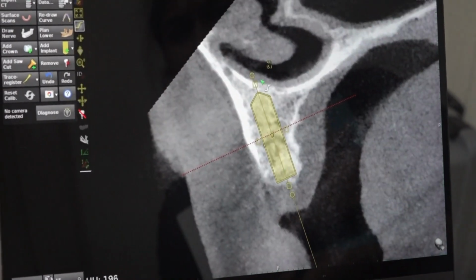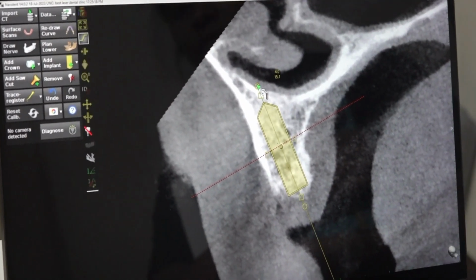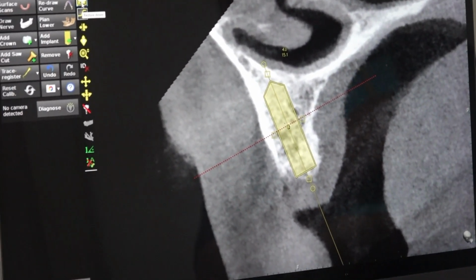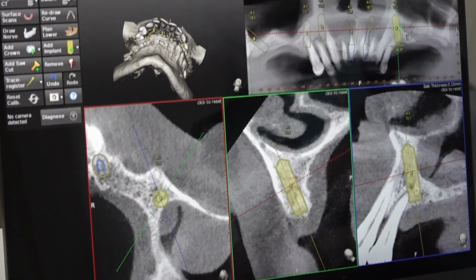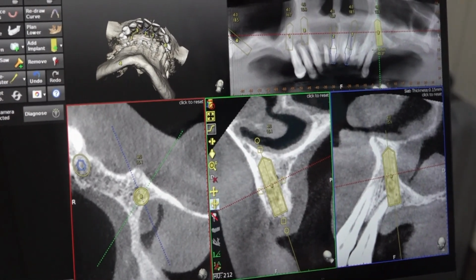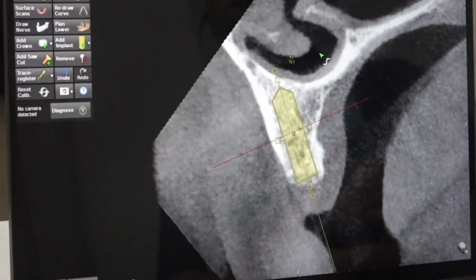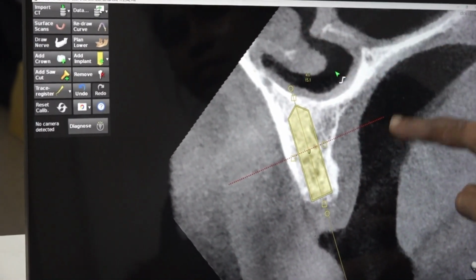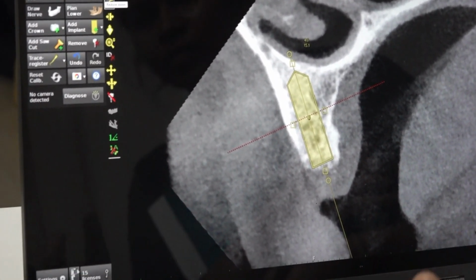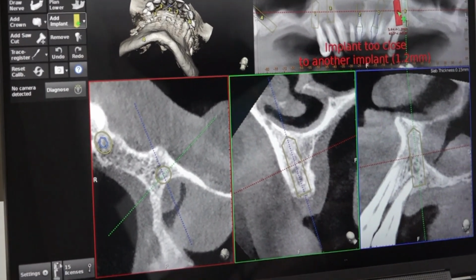So buccolingually, you can tilt either palatally or labially. You have a lot of freedom. That is why it is better to open the flap till here, so that you will get a sense of whether you are coming palatal or buccal. So actually this implant we are placing close to buccal. Can you understand? This is the nose, this is the palate, this is the buccal. So your eyes should get accustomed to the CBCT multiple section views, otherwise it's difficult to follow. This is a must.